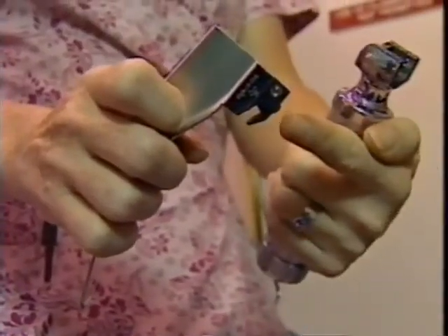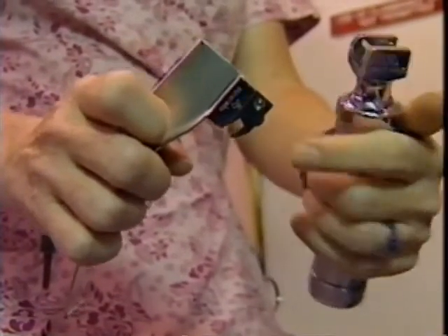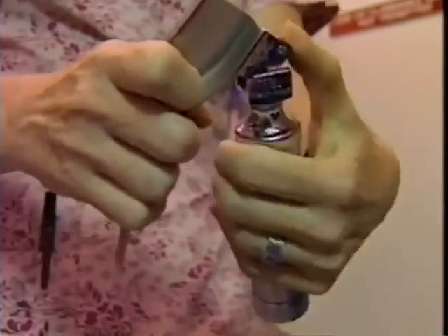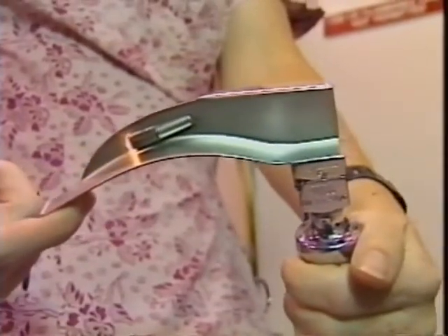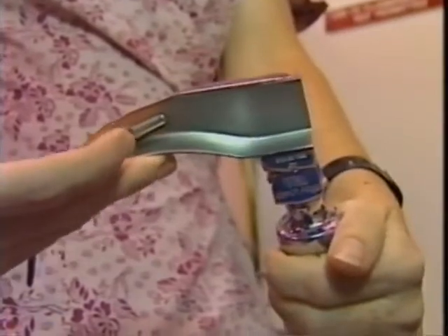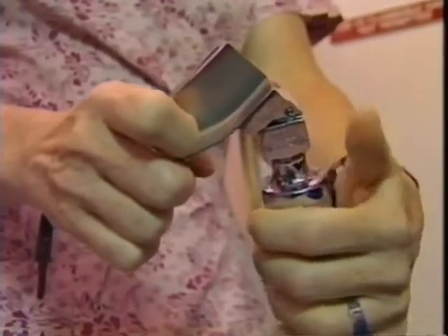To assemble the laryngoscope, hook the flange on the blade under the post on the handle and snap it into place. To turn on the light, pull the blade into a right angle with the handle until it locks. Conversely, folding the blade towards the handle turns off the light and allows you to remove the blade.